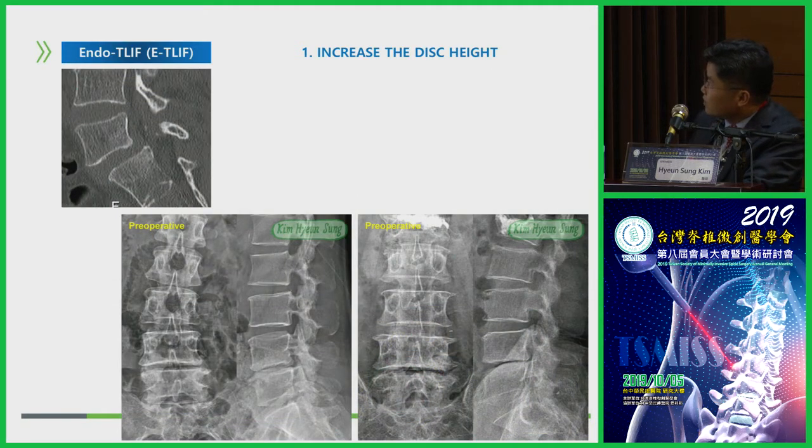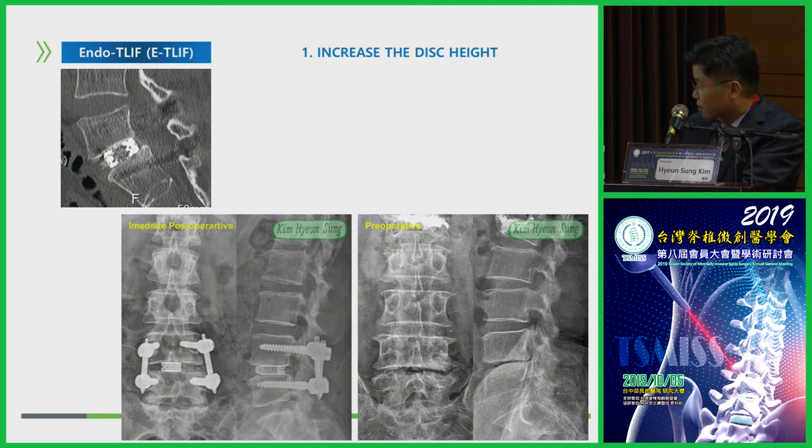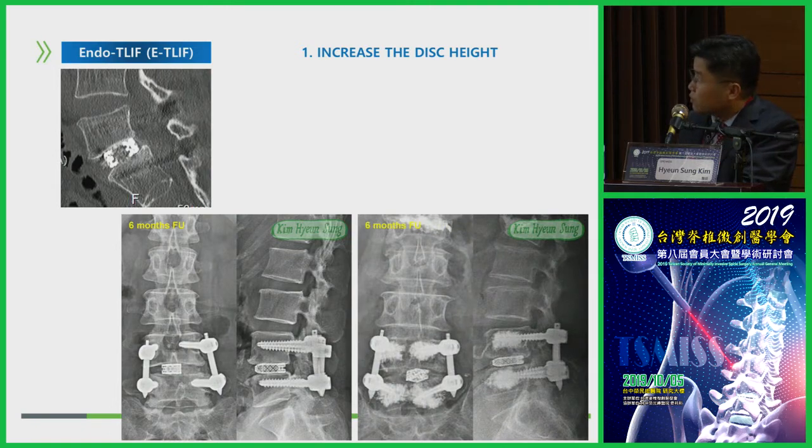You can also see some cases of my endoscopic fusion surgery. During disc resection, I always check that the disc height increases so much, and cage insertion is easier. You can see here, postoperatively, the disc height increased so much. In another case, it was not easy to increase the disc height, but after the operation the disc height increased so much, and 6 months later it is still well preserved. Another case also increased, the disc height is sufficient after operation, and 6 months later it is also preserved well.